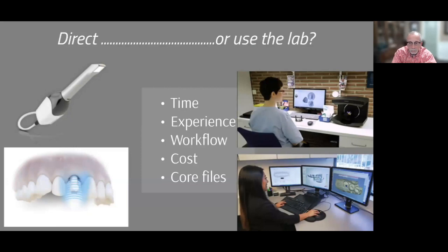Doing 20, 30 of these a day, we can do them pretty quick, right? A lab tech can sit down in front of a computer and get that abutment ordered from your scan in under 10 minutes, right? Because they do 20 a day. In a dental office, you may do one a month, two a month, right? One every couple of months. And so getting the workflow down is repetition, just like anything else. And if you're not doing it repetitively, it's going to be hard to get into a flow.